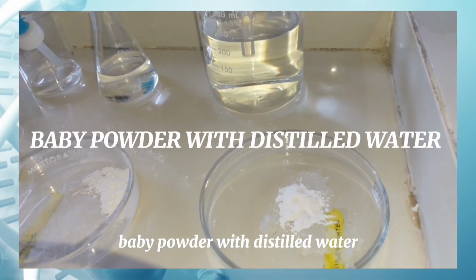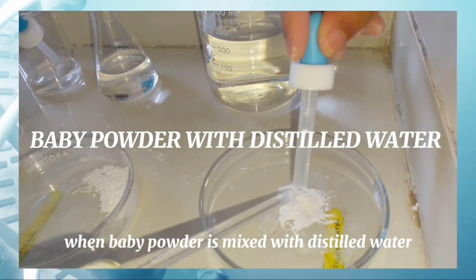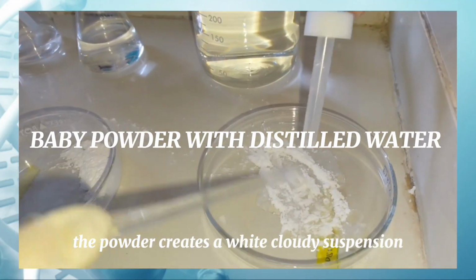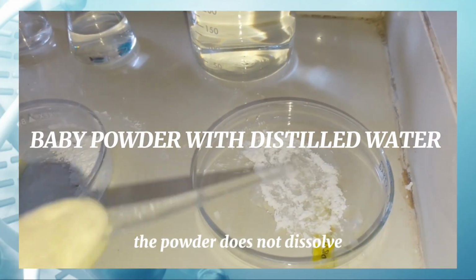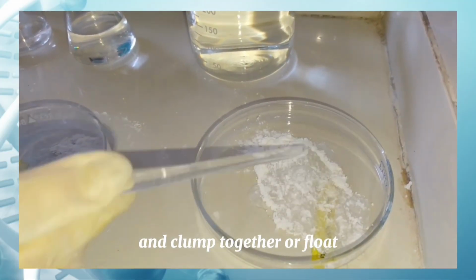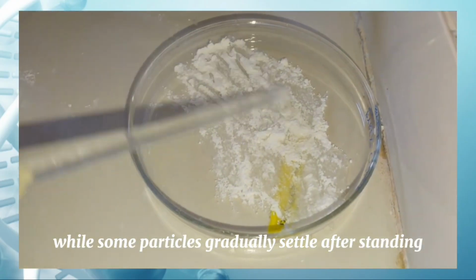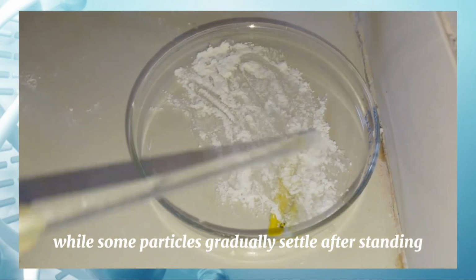Baby powder with distilled water. When baby powder is mixed with distilled water, the powder creates a white cloudy suspension. The powder does not dissolve and may clump together or float, while some particles gradually settle after standing.